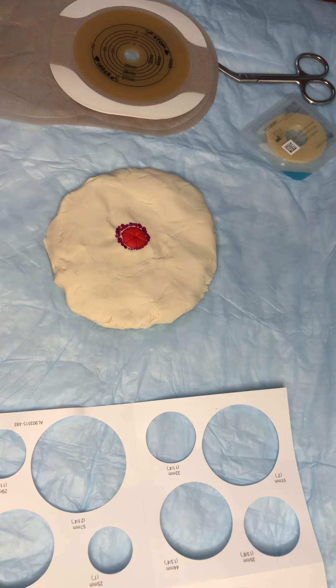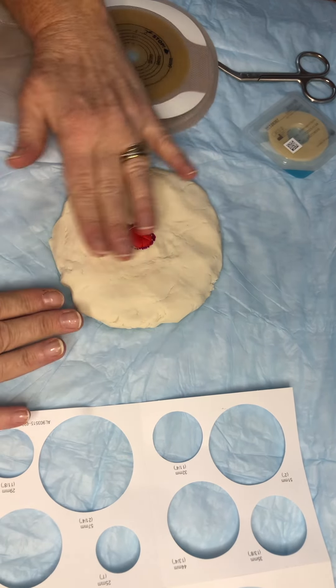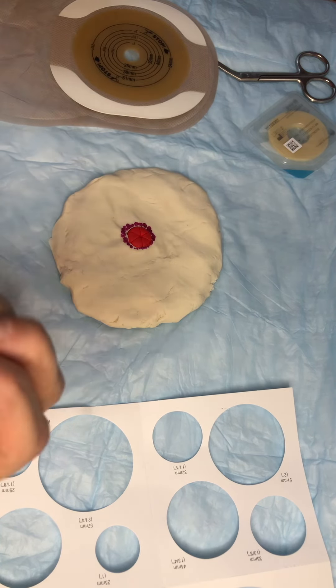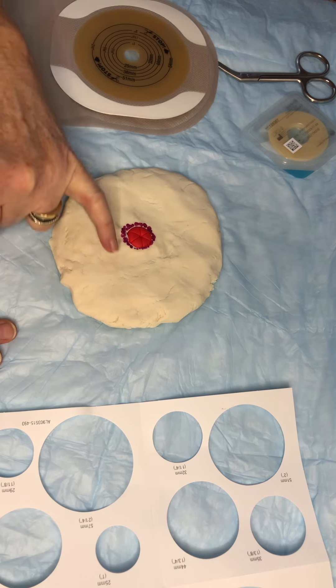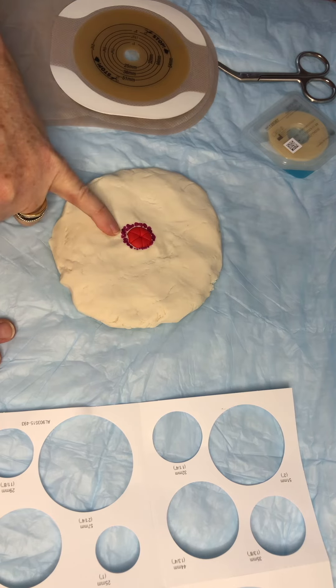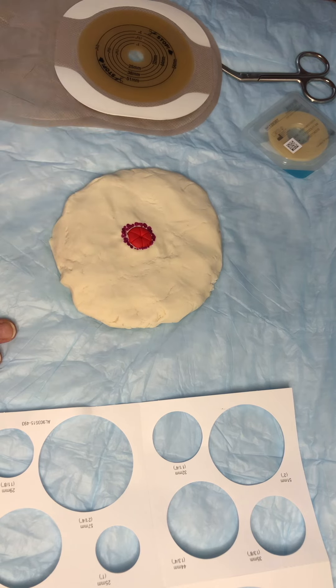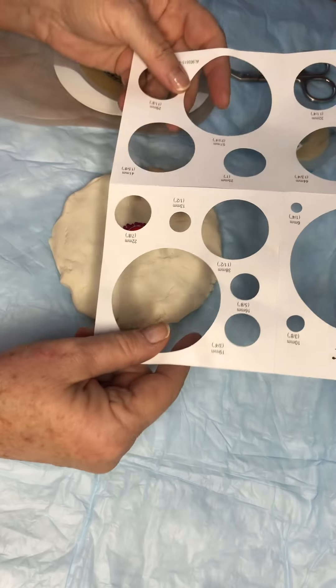Here's how we're going to pouch a stoma that has recessed. As you can see, I've got the play-doh kind of all the way up, right at skin level to the stoma - and this is the same process if it's completely retracted. You'll see here that I've got a bit of the peristomal area right next to the stoma that's irritated.